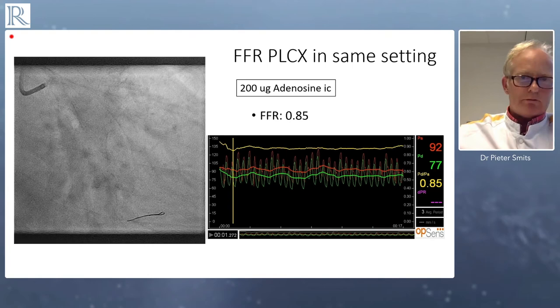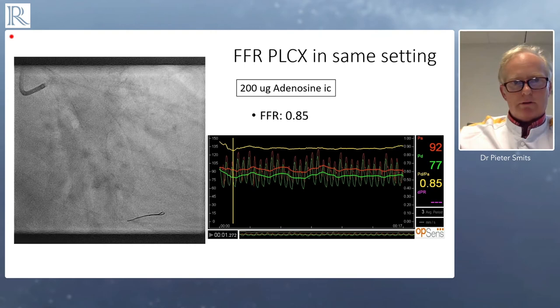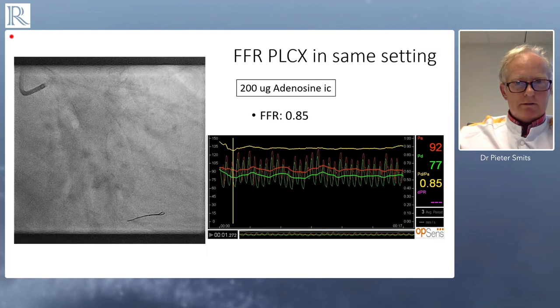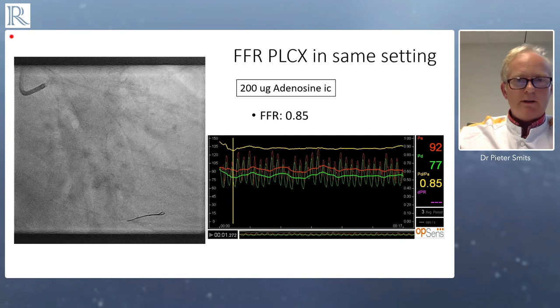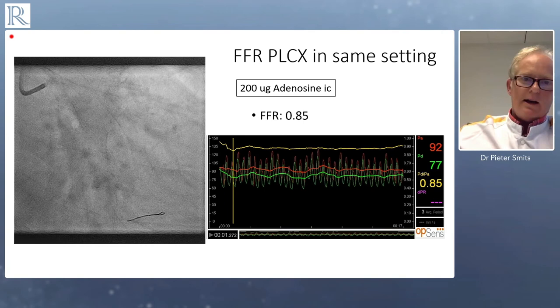It was a nice discussion. I did FFR in the posterolateral branch in the same setting. We gave 200 micrograms of IC adenosine. You can see here the result with the Optowire: FFR 0.85. No need to intervene in that specific vessel or lesion.